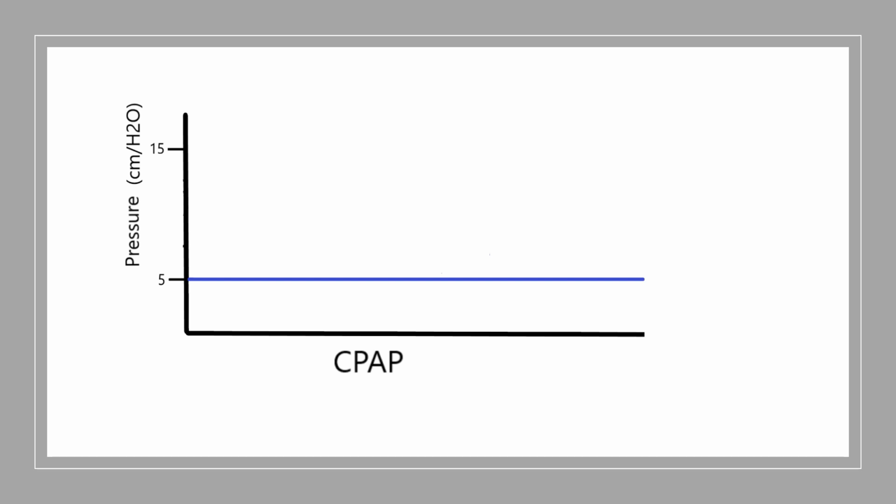That's continuous positive airway pressure. There's multiple ways that you can apply this to a patient. You can use standard CPAP devices, which use high flow oxygen at really high flow rates to generate that pressure. There's sealed mask type devices, which can create that back pressure, or you can do it in a very basic format with just a PEEP valve and a BVM.